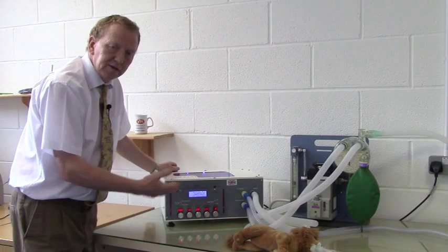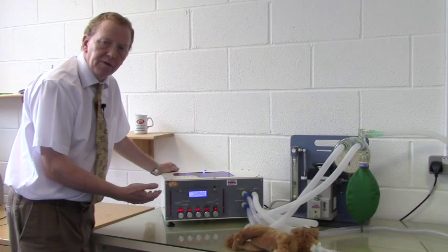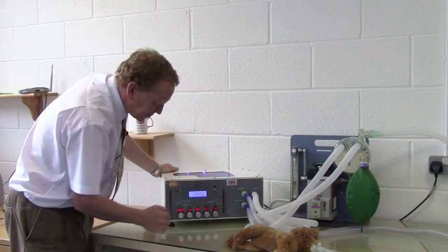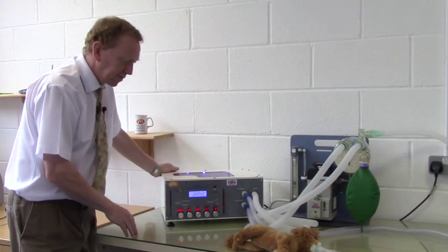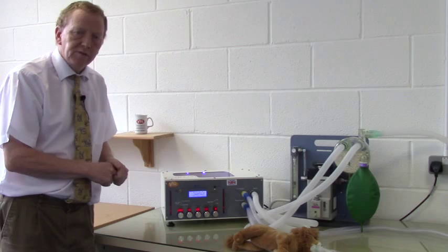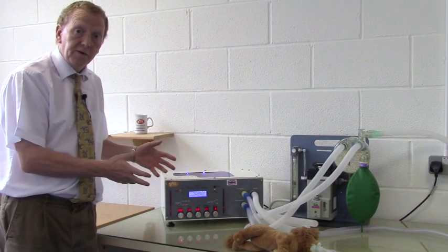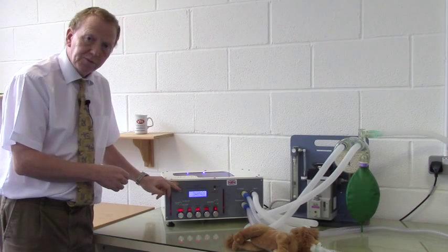Our maximum airway pressure is, as described before, a safety circuit limit. We'll leave this at roughly 5 to 10 centimetres above our anticipated maximum, which will probably be about 15, so we'll set this to 25. The assist mode threshold is not important in this setting, as the assist mode will be off. Having set this configuration up and having the fresh gas flow set — at the moment I've got this running at about one and a half litres, which is in excess of the requirement of a rebreathing circuit, but in the initial stages it allows the circuit to quickly raise the isoflurane anaesthetic agent concentration. So I'll leave it slightly higher for the moment, and now we just put the ventilator to run.